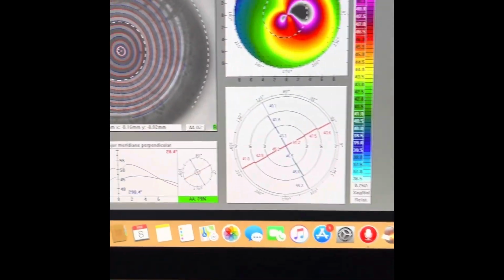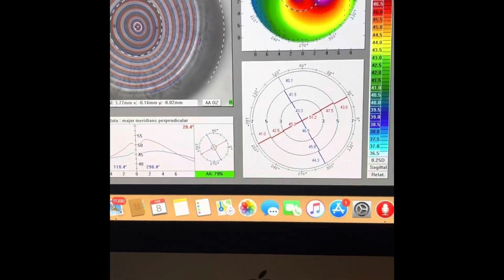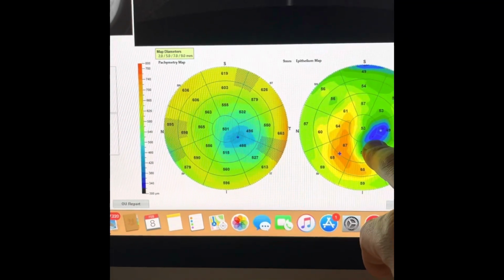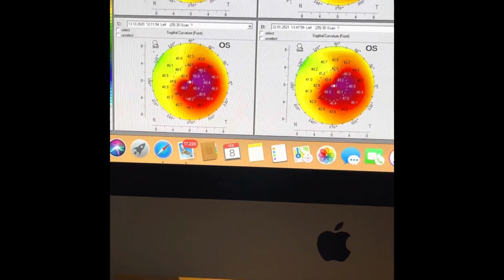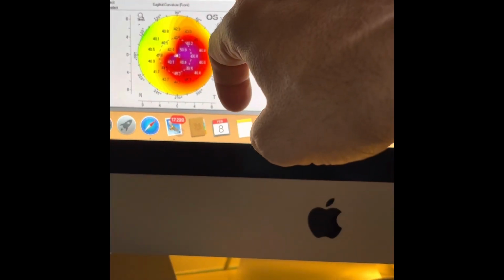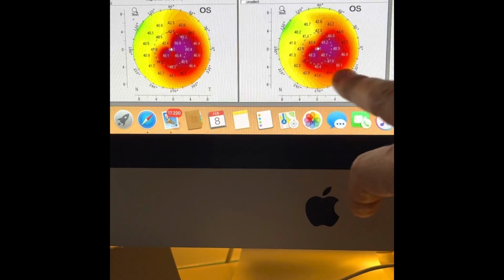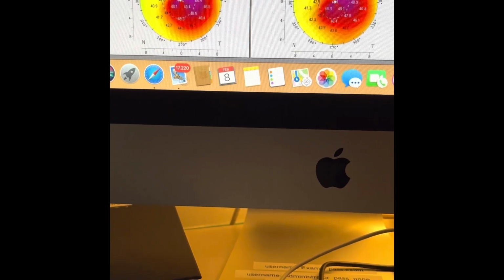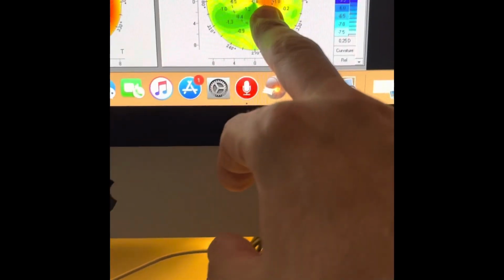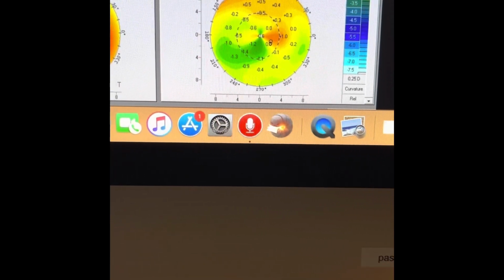Let's look at some more images. This is his cone. Many people would call this claw-like and pellucid marginal, but we saw here, this is definitely not pellucid. This is an oblique infratemporal cone in the left eye. These are now his sequential Pentacams from 2015, 2017, 2020, and January of 2021. And we can see that there's a progression of the cone, a certain jump from the past of 1 diopter, as we can see here. And this, along with the epithelial maps being activated for us, is a significant enough reason for him to undergo the Athens protocol.